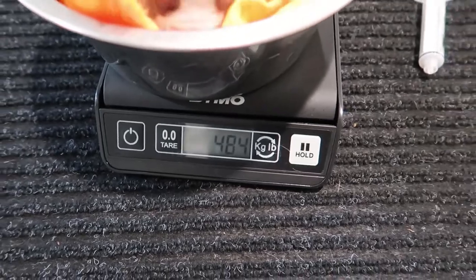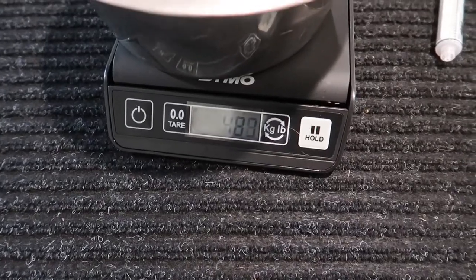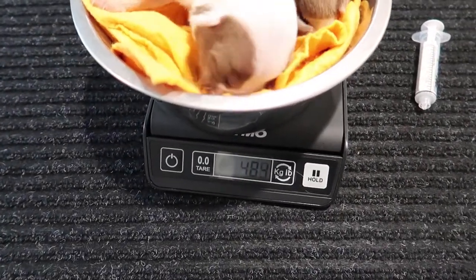We'll calculate that in ounces. You want to do about 1cc per ounce, or 1ml per ounce. This one's already been feeding from the mom too, but I'm just going to show you guys how to do it.